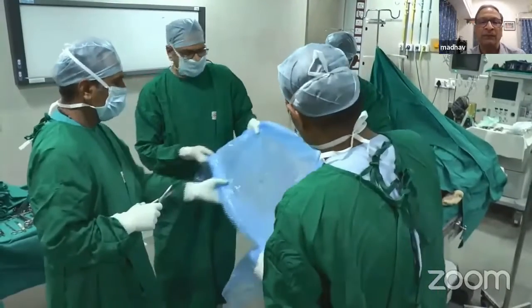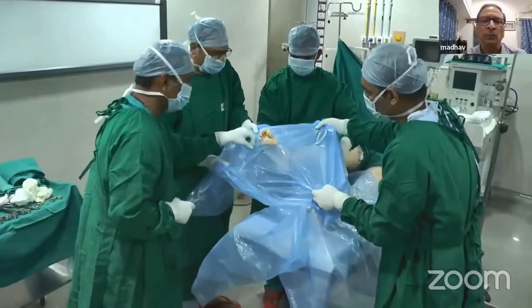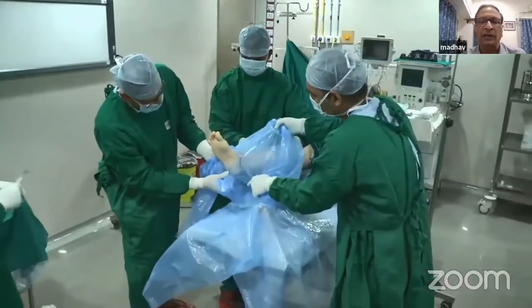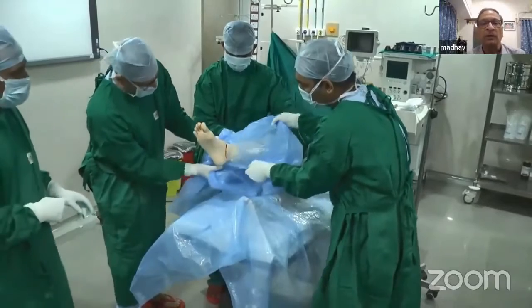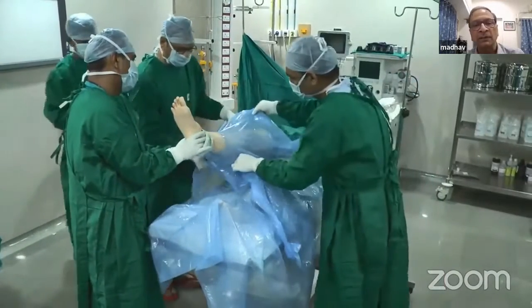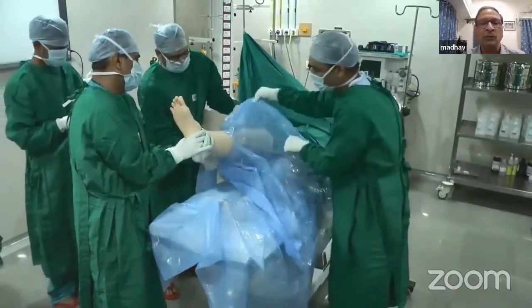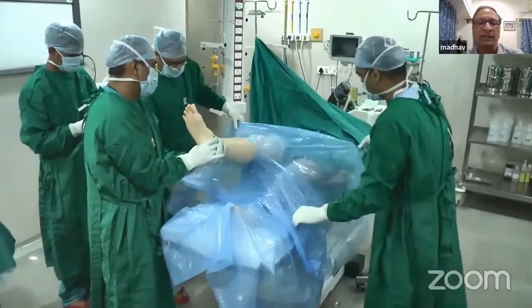Once you have threaded the foot through the small hole, you pull the sheet up the leg until you isolate the amount of leg you want to keep open — the operating area. Because the leg becomes wider as you go up, the sheet automatically tears and accommodates the leg as you pull it up.